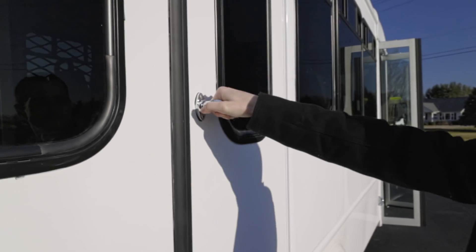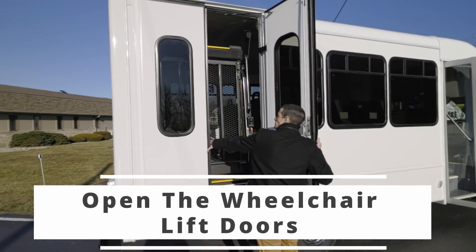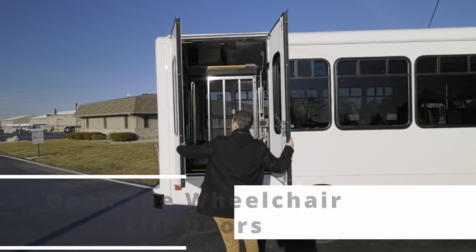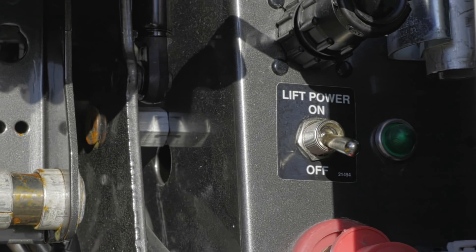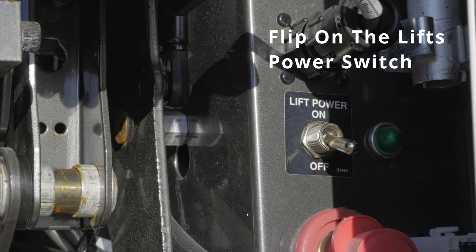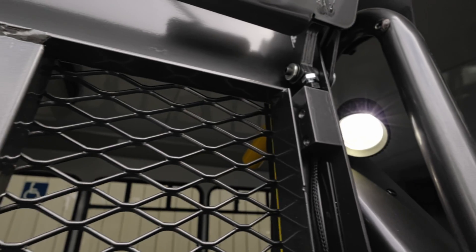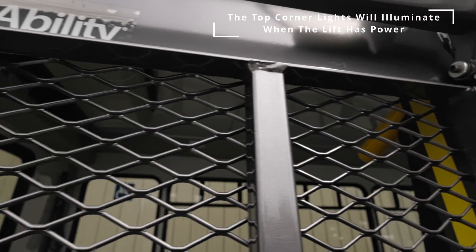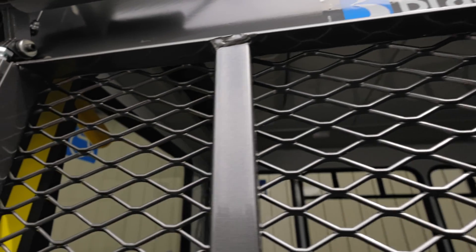Next, you'll want to gain access to the lift by locating and opening the doors. Now that we have access to the lift, find the power switch that will typically be located at the bottom left or right-hand side of the lift and make sure that it is flipped to the on position. Once the lights at the top corners of the lift are illuminated, you'll know that the lift has power and is ready for use.